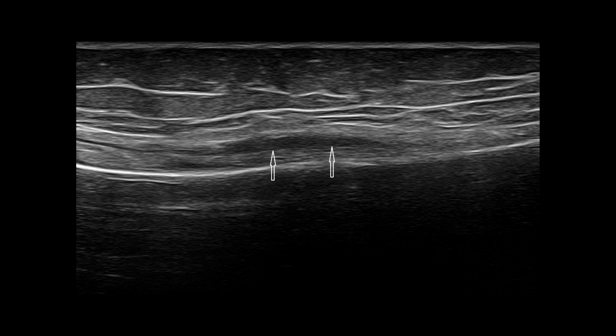The abnormal echotexture is most evident at the level where the tendons cross the distal portion of the medial collateral ligament. This pattern suggests more extensive overload of the Pes Anserinus complex. Such combined involvement may be associated with increased mechanical stress along the medial aspect of the knee.